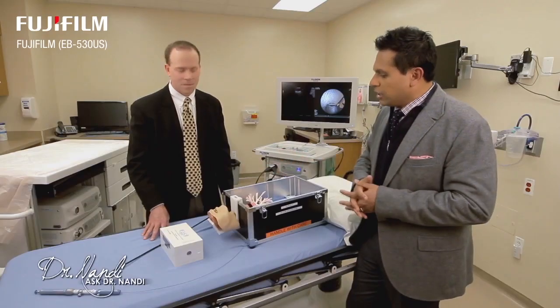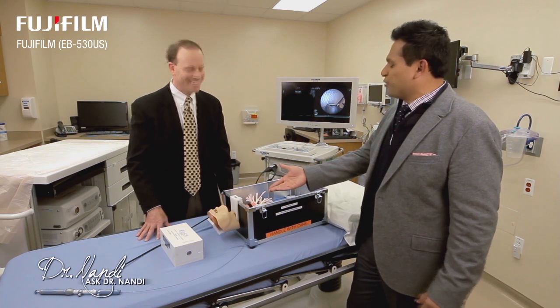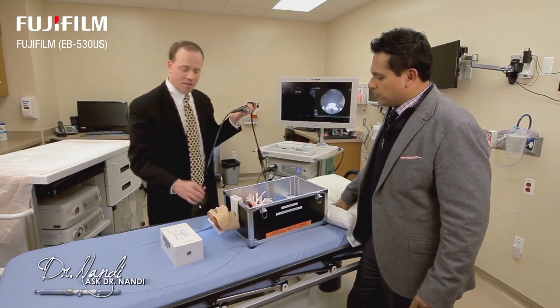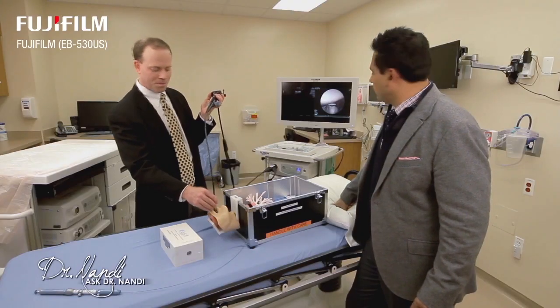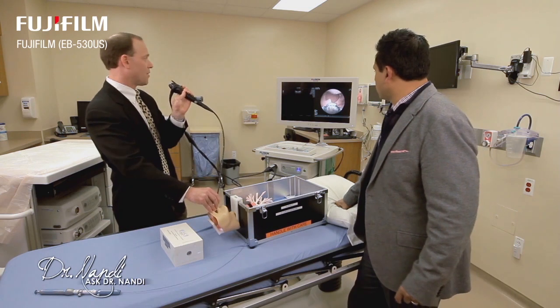So show us maybe a little, obviously we don't have a patient, but we've got a model here. Maybe you can go through how we do that procedure. Absolutely, I will. Give it a try. All right. So typically, when we do this procedure, we can usually go either through the nose or the mouth, but for this demonstration, we'll go through the mouth. And what we're seeing here is the back of the throat.